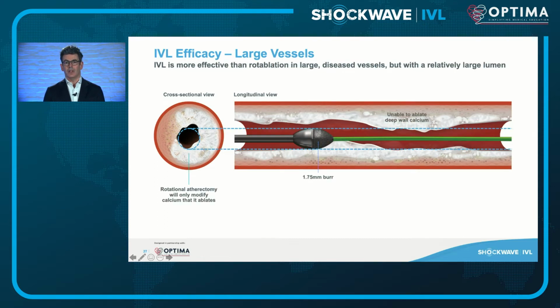So you may need to prepare the vessel with a crossing device such as rotational atherectomy, but remember that atherectomy will modify only the intimal layer of calcium. It will not touch the medial calcium. The only technology currently that can do that is IVL.